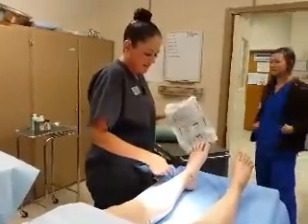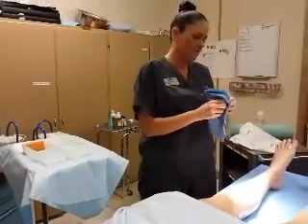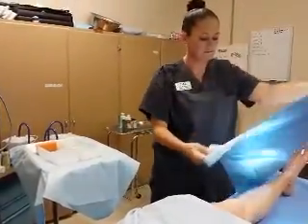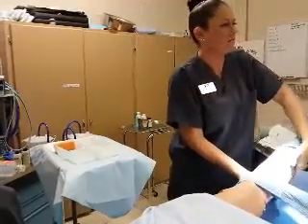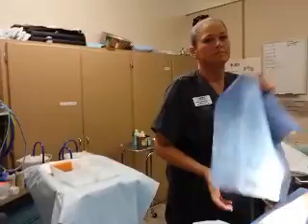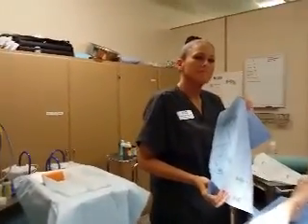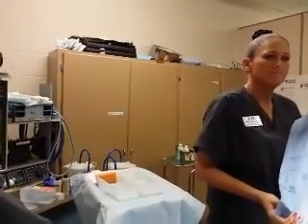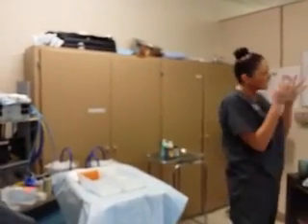So when you guys are practicing, one thing you're going to practice is how you like to open your towel, which way works best for you on a leg. Going this way lets you get all the way around. If you're doing a bunionectomy, or a hammer toe, and you're doing your arounds, are you going through each toe? On a person, you will, because their toes are flexible.